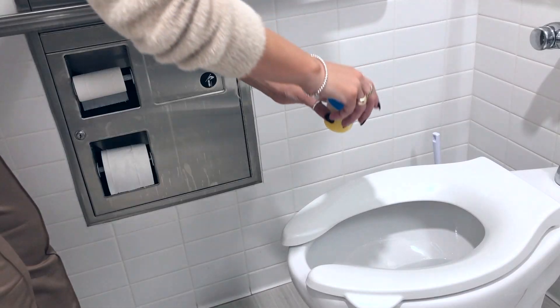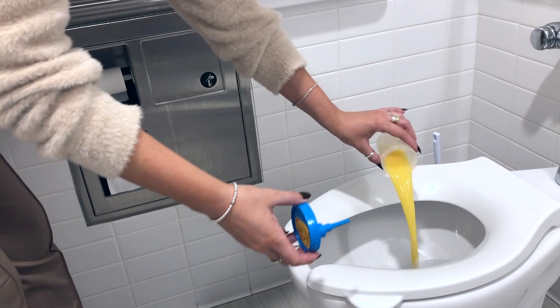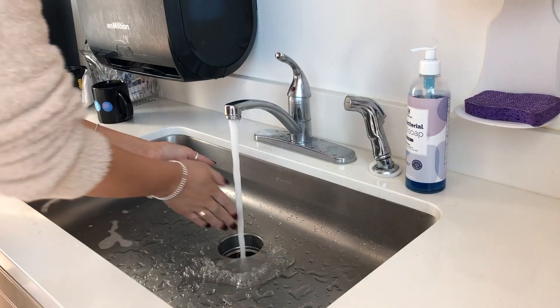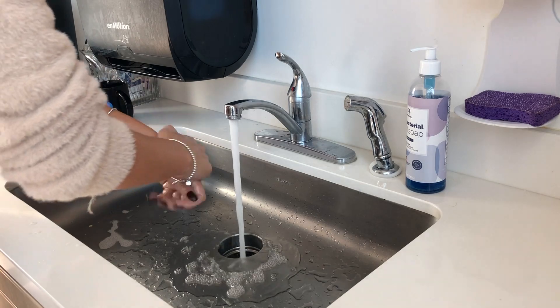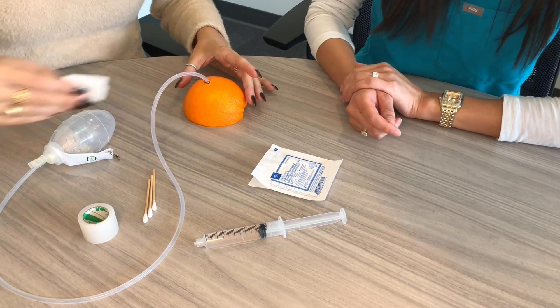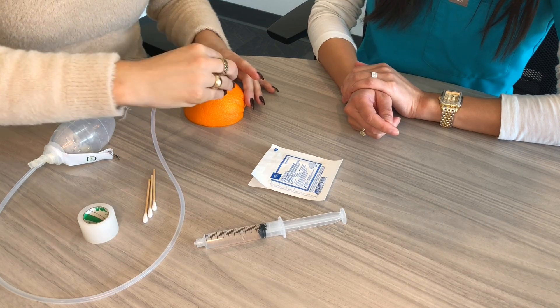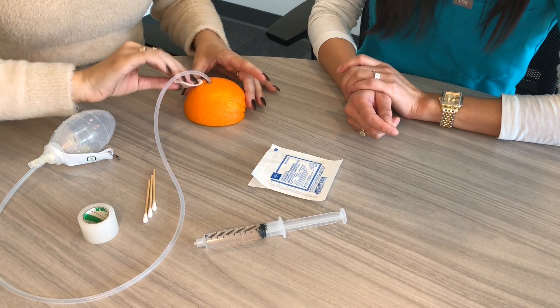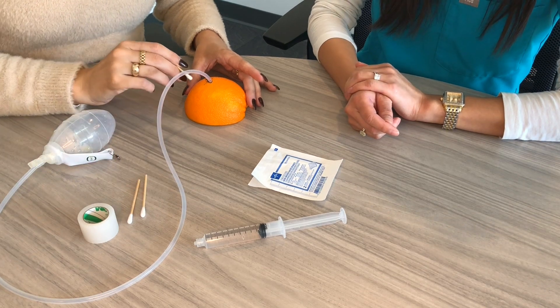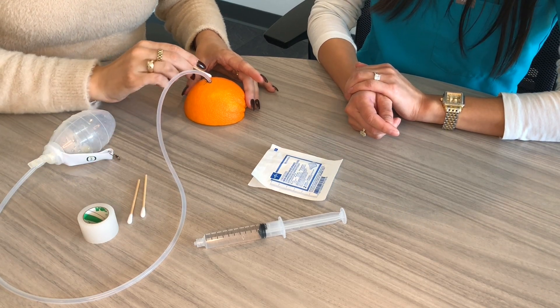Discard the drainage into the toilet. Rinse and wash the measuring container with soap and water. Then go ahead and wash your hands with soap and water again. Clean the skin around the drain site with the cotton tip applicator or gauze moistened with saline, and wipe in a circular motion. Be careful not to tug on the sutures.